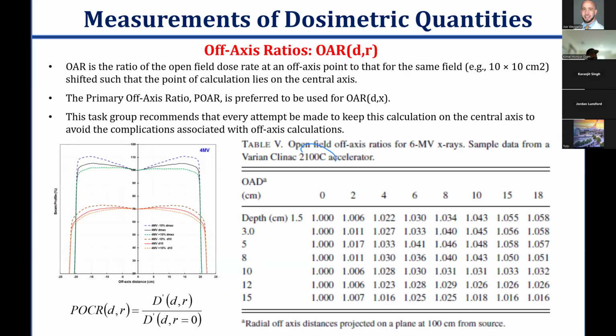Two, there are horns. When you look at the 4 MV, you could see that there are horns. Horns represent regions of higher intensity, and typically they are a result of the presence of flattening filters, and they are more pronounced at shallower depths and diminish as the depth increases. The rationale for the creation of horns is the gradual decrease in photon fluence away from the central axis, partly caused by in-scatter and out-scatter imbalances and changes in the effective beam quality as the depth changes.